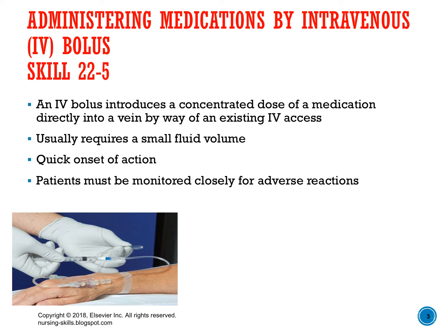So you have to be really careful about that. They can cause abscesses or sloughing off of the tissue. So we always want to make sure that the IV catheter is still in the vein before we administer anything.